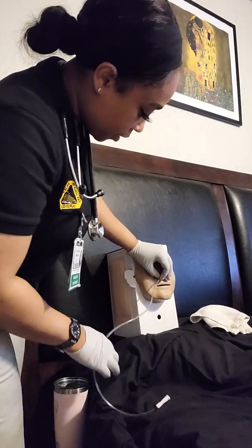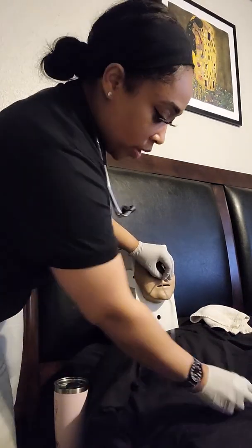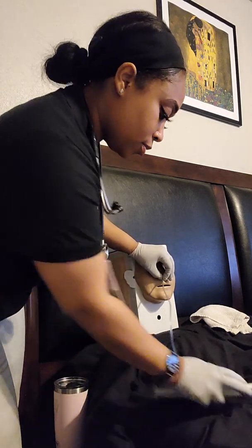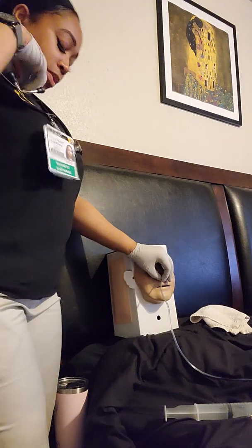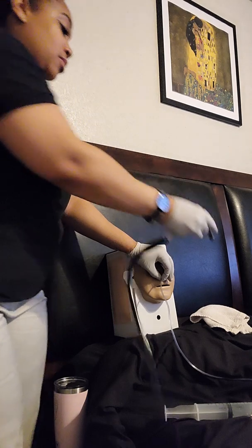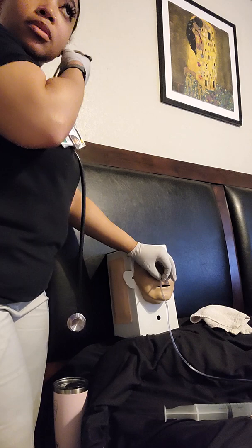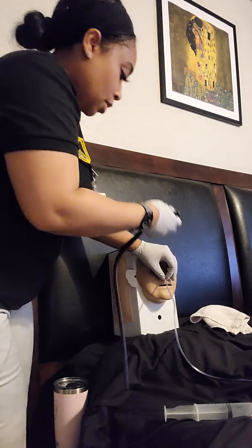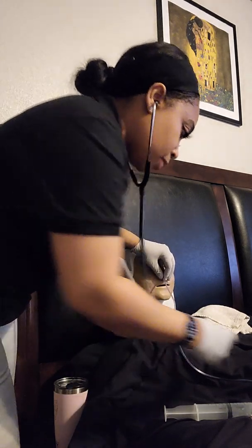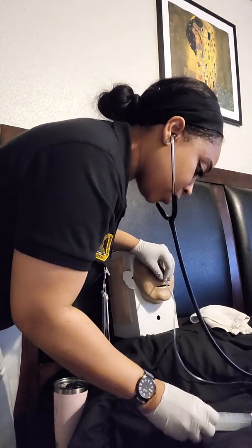Okay, how are you doing? Are you okay with breathing at the moment? Okay, perfect. So now I'm going to grab my piston syringe and insert it to the tube. All right, let me put my stethoscope back in, so I can listen for the air being pushed through. I'm going to have you hold that for me really quick. I'm sorry. All right, perfect. All right, place this on your stomach. Okay, push in the air. Oh, I heard the whooshing sound. I'm going to aspirate.